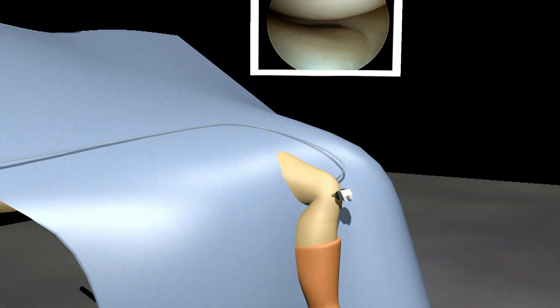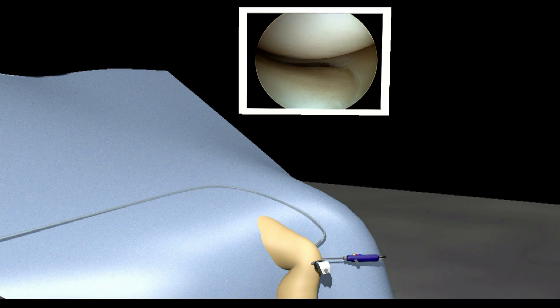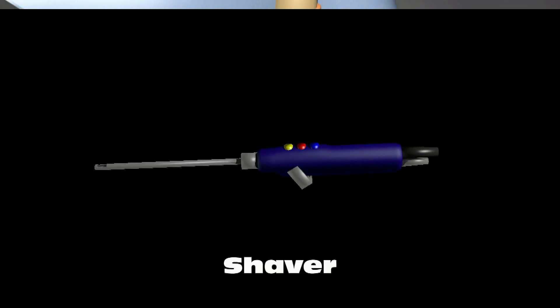A third small incision is made so that instruments can be passed into the knee joint to work. One such instrument is known as a shaver. The surgeon uses the shaver to gently remove damaged tissue from the knee.